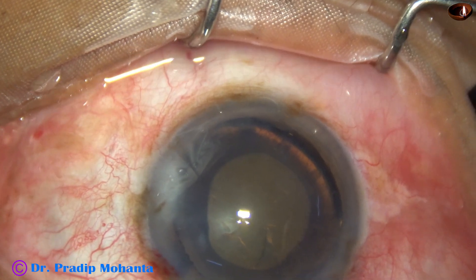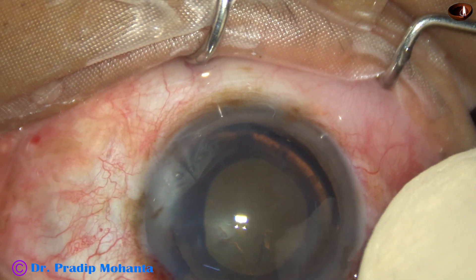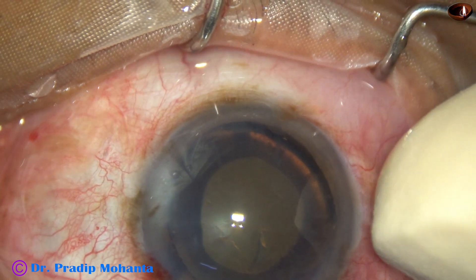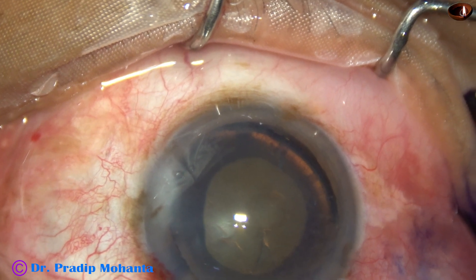So, a slightly eccentric rhexis. Now hydrodissection is not done — instead, hydro-free dissection is performed, meaning the separation of the capsule from the cortex is done with a spatula.